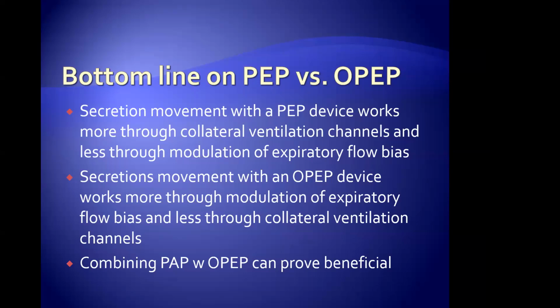I increase the liter flow from 5 to 7 to 8 liters maybe, and my FiO2 stays the same that I'm delivering because it's going through Venturi. I'm PAPing the patient. I'm giving them some PEEP, positive airway pressure. Now I'm modulating, breaking that up. Can that prove to be beneficial? Yes. And we do that every single day with the patients that we're moving through the continuum of care.